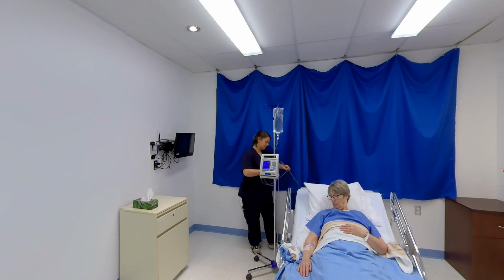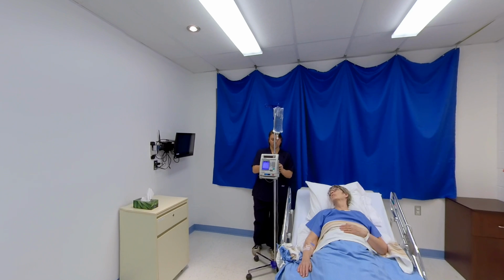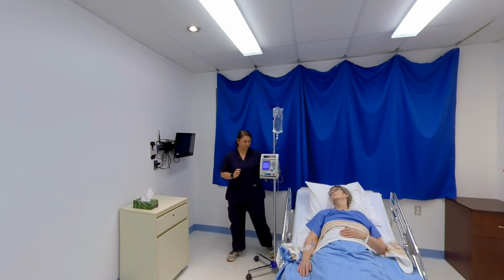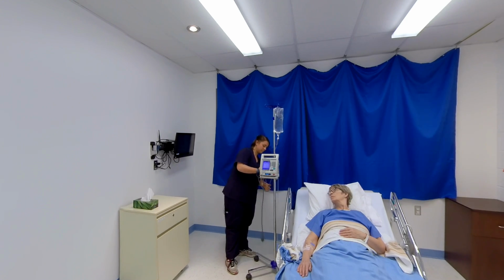The user can walk about with an IV infusion if it is attached to a wheeled stand. Also, make sure the IV bag is above the insertion site at all times. The pump should be disconnected and then reconnected to an outlet to stay charged.